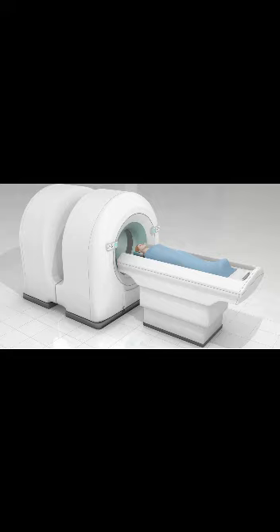How long are you radioactive after a PET scan? You will not be radioactive after a CT scan. With a PET or a PET/CT scan, you will give off very low levels of radiation for around 6 hours afterwards. As a precaution, you should avoid being close to women who are pregnant during this time.